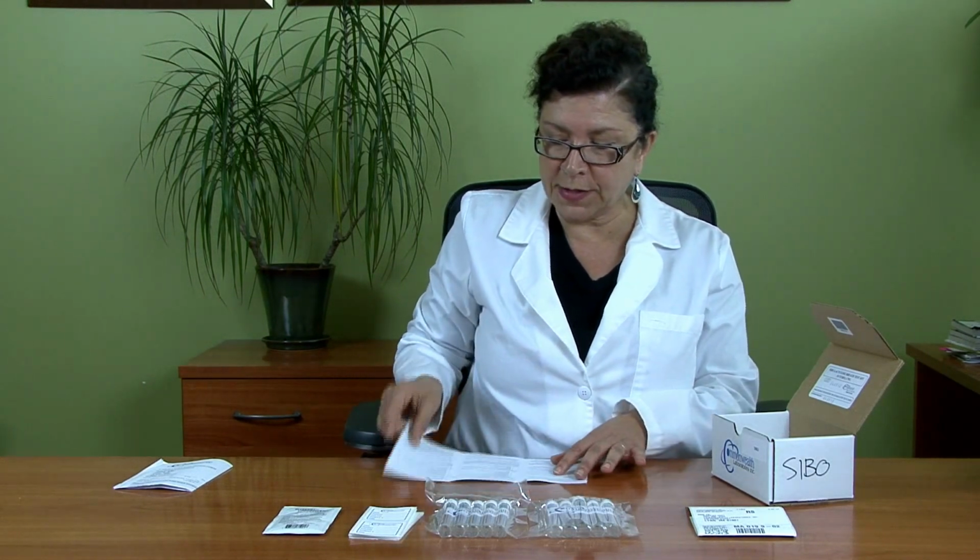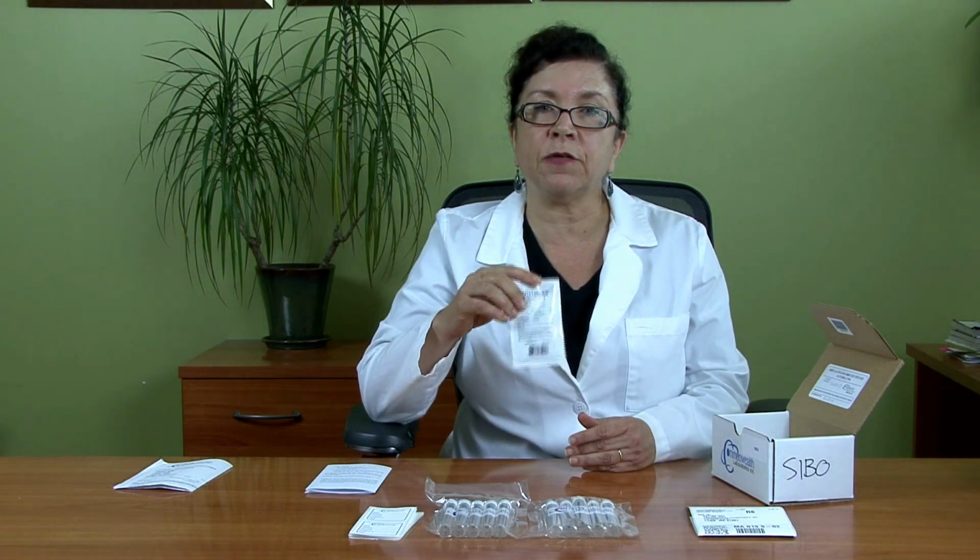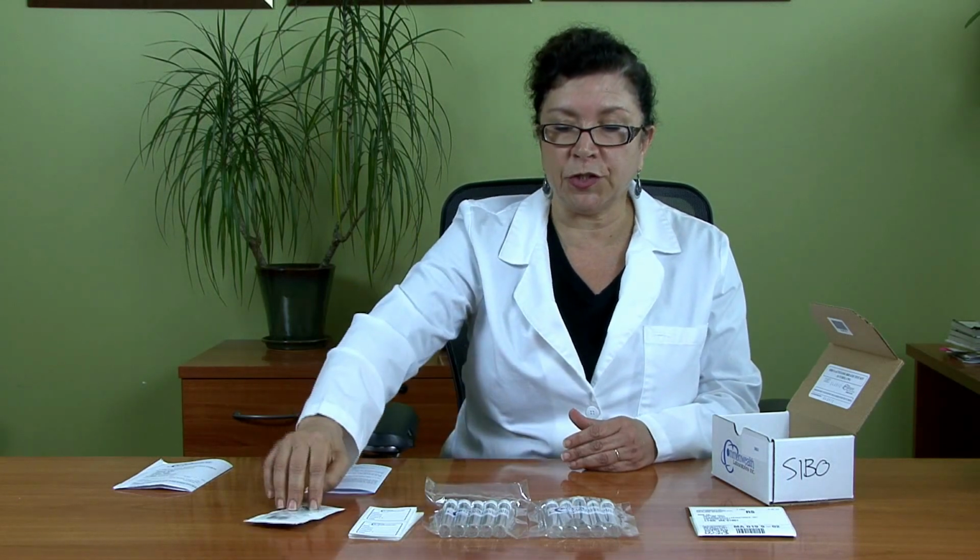So let's go ahead and close this up. So prior to starting the test, go ahead and prepare the Lactulose sugar. You'll have to dissolve the sugar in 4 ounces of water. So go ahead and open it up, pour it in the water, stir it up, set it aside, because as soon as you get your fasting specimen, you will immediately drink the sugar solution.